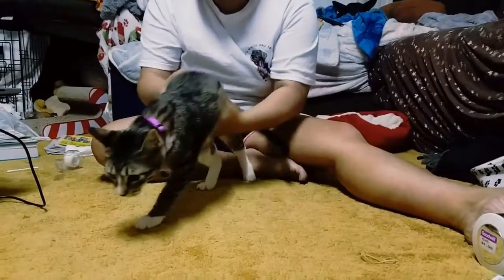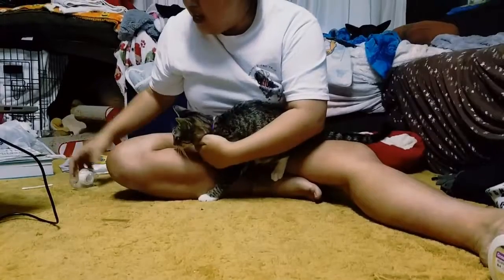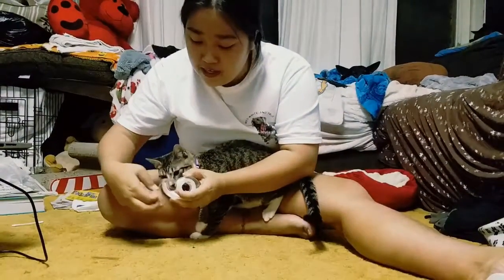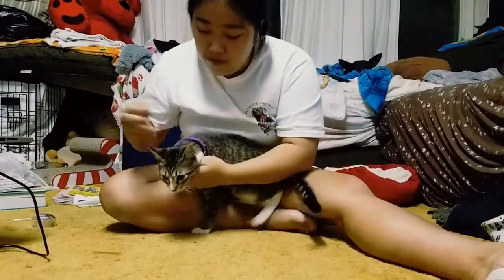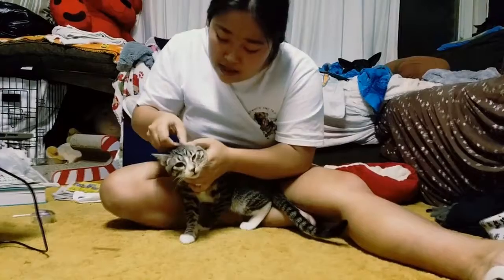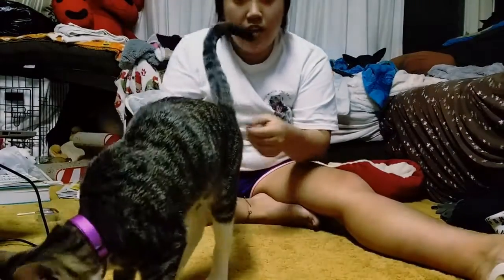Okay. So to do a tape test, you're going to first have your slide, and you're going to put mineral oil on it. And you're going to get a piece of clear tape, and then wherever the lesion is on the animal, you're going to stick it to it, pick it up, and then put it right on the slide. And then you're going to look under the microscope.